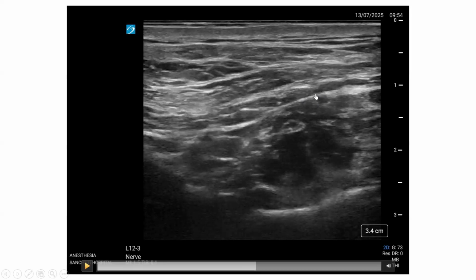So you can get your needle lateral to the suprascapular nerve and block this with hardly 1 ml of local anesthetic. In fact, we had studied between 1, 4, and 7 ml, and we found that even 1 ml is quite sufficient to block, but it does not fulfill the criteria of an optimal block in the sense related to the anatomical aspect: local anesthetic which goes circumferential becomes an optimal anatomic block.